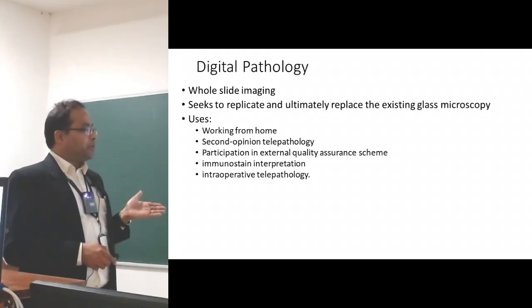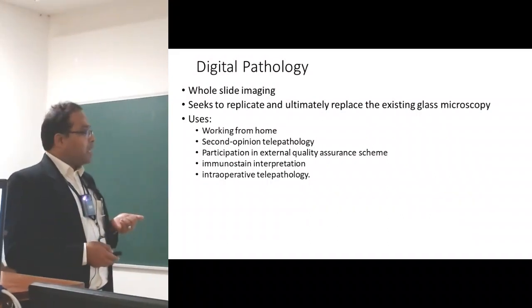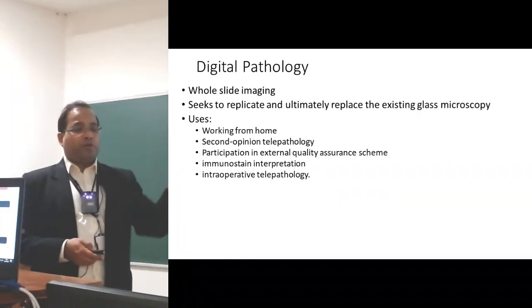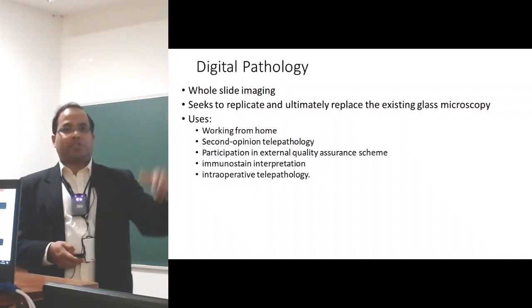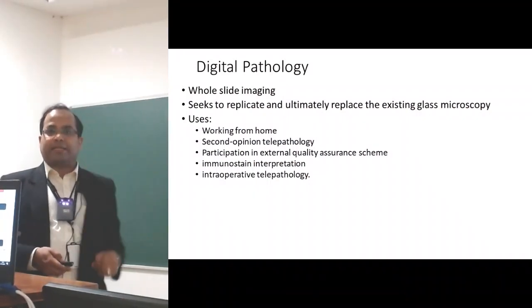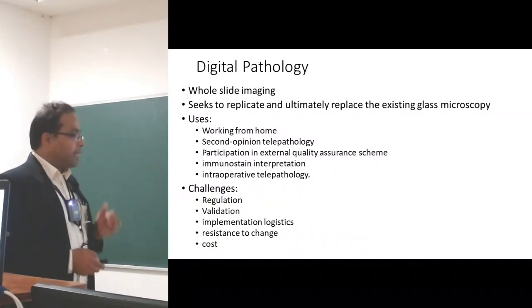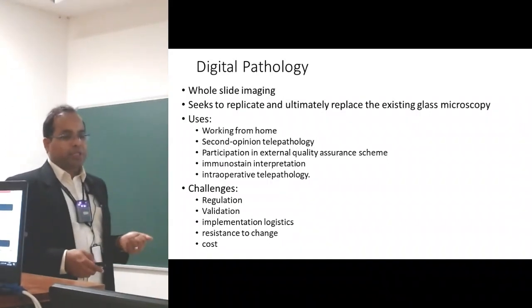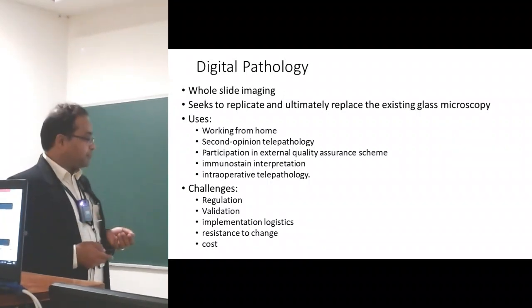Immunostain interpretation and intraoperative telepathology can also be done with digital pathology. Intraoperative is that suppose you don't have a neuropathologist in your lab. So you can scan it and can send it to somebody else. He can scan and can say the diagnosis while the patient is waiting in another hospital for the diagnosis. But there are challenges. There are challenges of regulation, validation, implementation, and pathologists are resistant to change because they are more comfortable with the glass microscope.